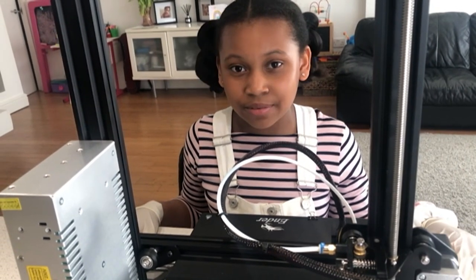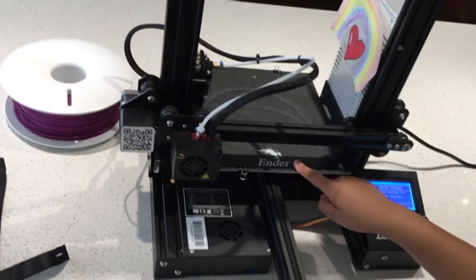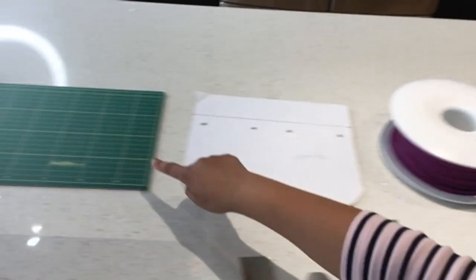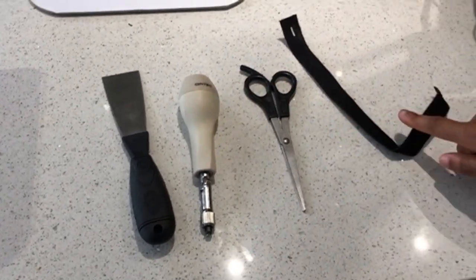I'd like to show you how I make my visors. You are going to need a 3D printer, some PLA plastic filament, a template, a cutting mat, a piece of A4 plastic acetate, a scraper, a hole puncher, some scissors and some elastic.